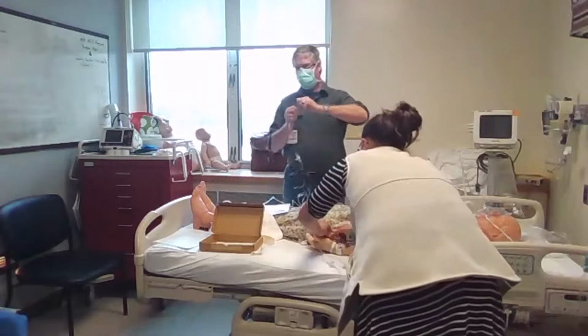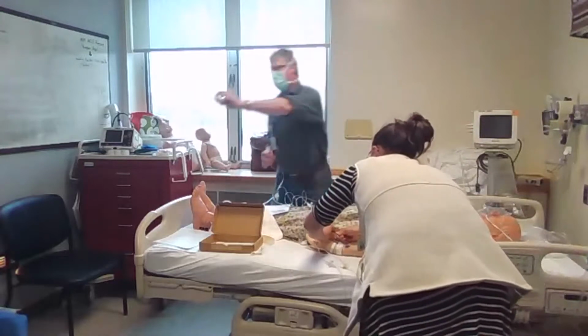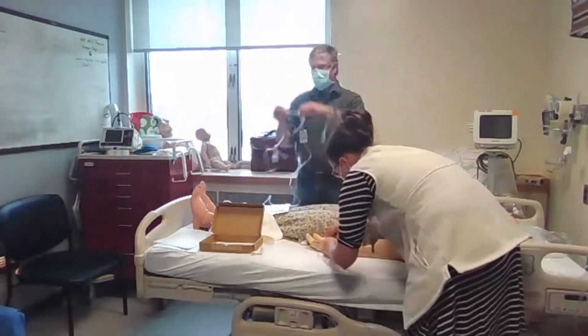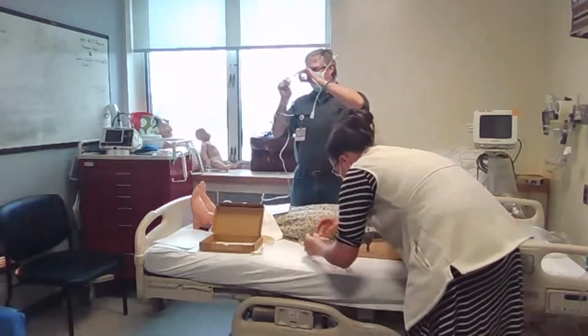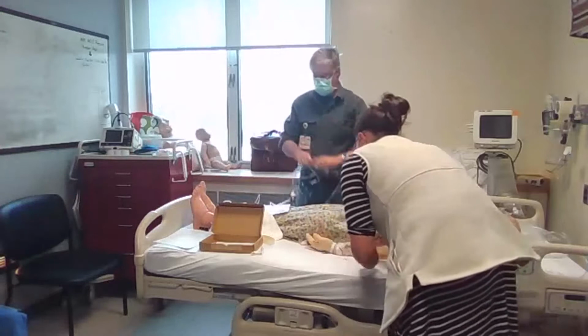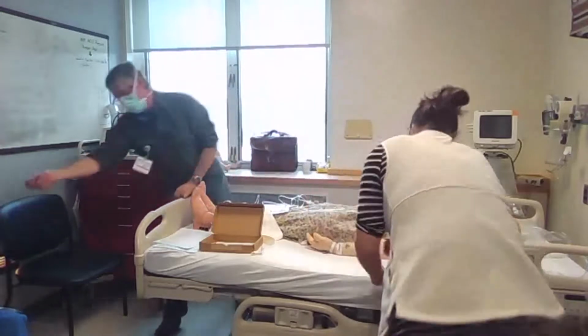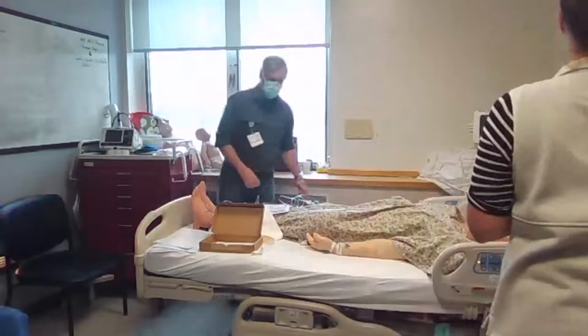So these little white ones, and you can pass this around, have a hole in them. So there's one at the end, and there's one at the three-way stopcock with the transducer. So as you can imagine, they've got a hole in them. They're gonna shoot out, right?